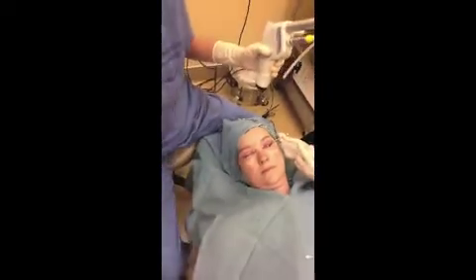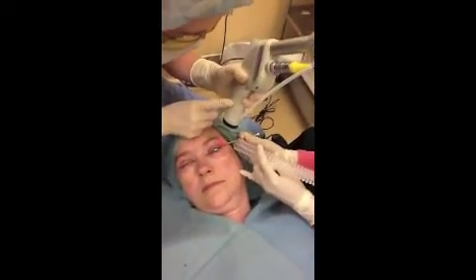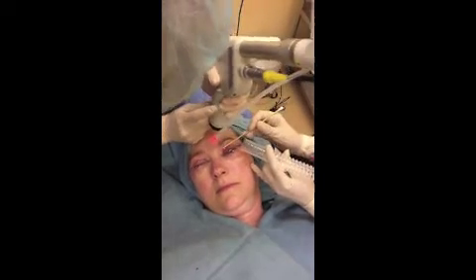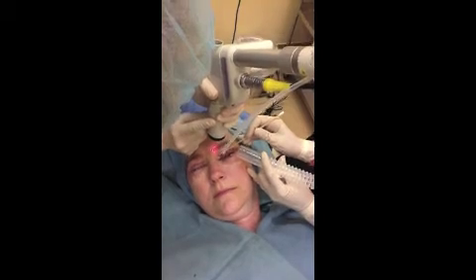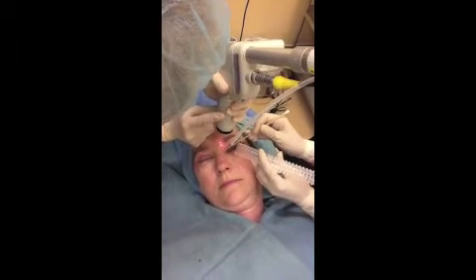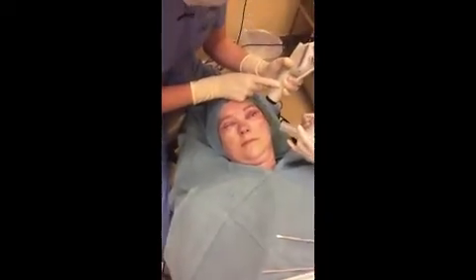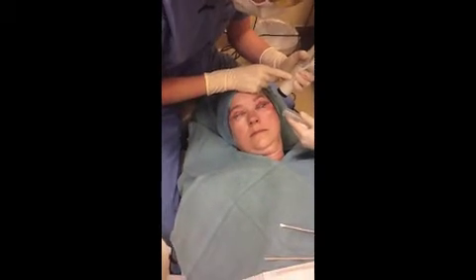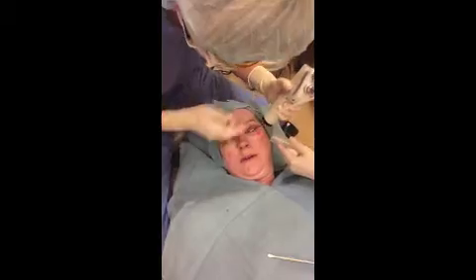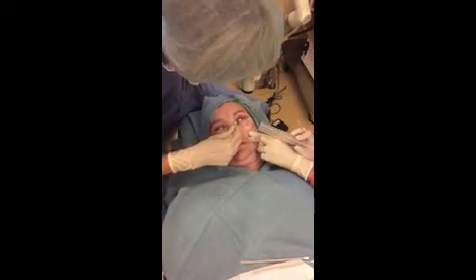I need to decrease the size one — hold on. I need to get a chance. I'm going to turn soon and I can't even see it. You got it. Do you want to hold this? Oh! That's the work of it. You're doing great. Look up to the back wall for me.